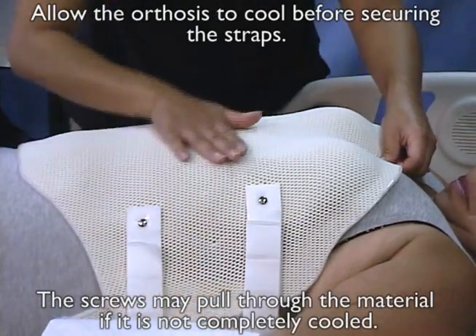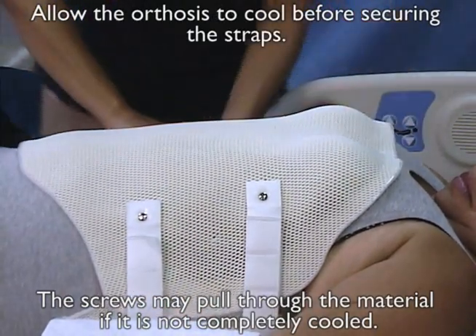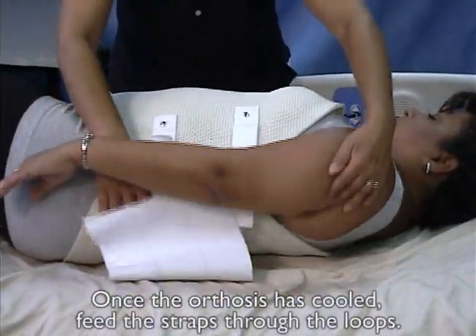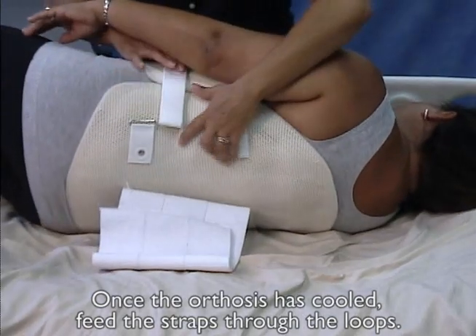Allow the orthosis to cool before securing the straps. The screws may pull through the material if it is not completely cooled. Once the orthosis has cooled, feed the straps through the loops.